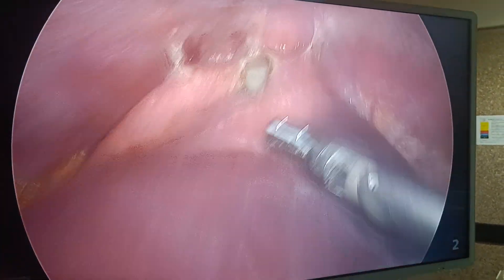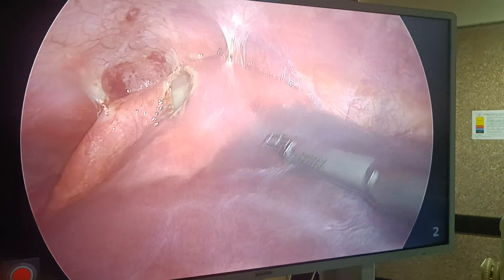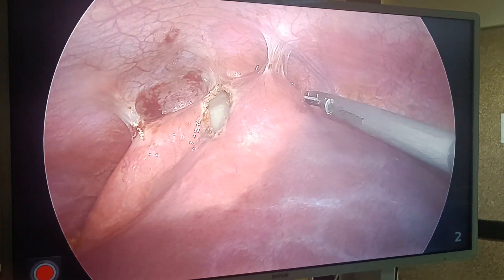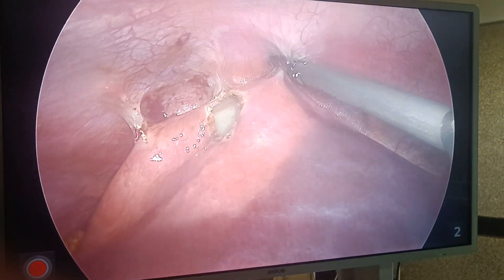Good morning, I am Dr. Aviral. You can see this is the liver, this is the right lobe, and this is the diaphragm. This is a case of hydatid cyst of liver. This young lady has been having a hydatid cyst for one to two years and is symptomatic.